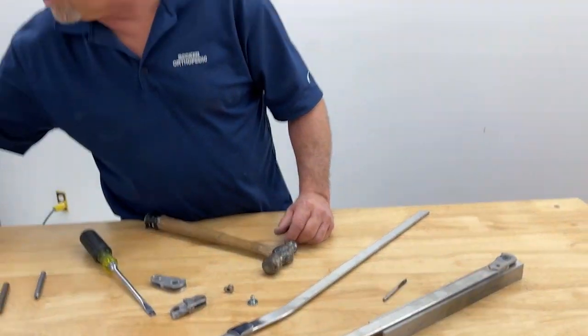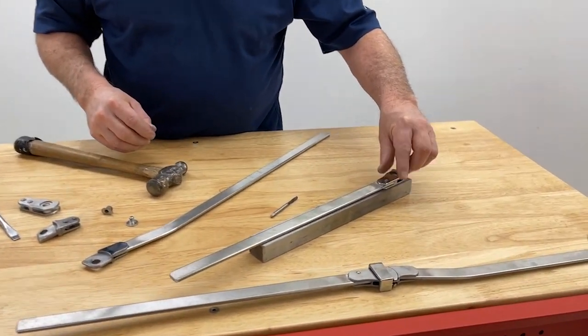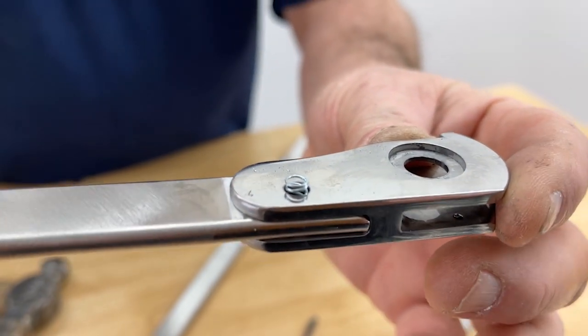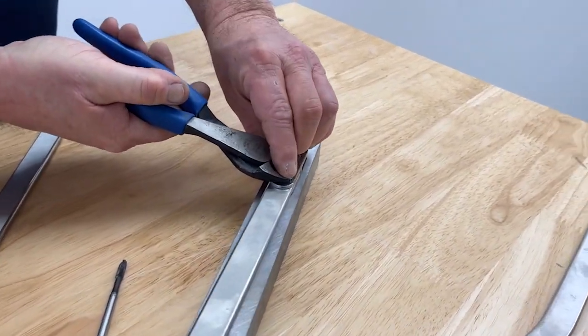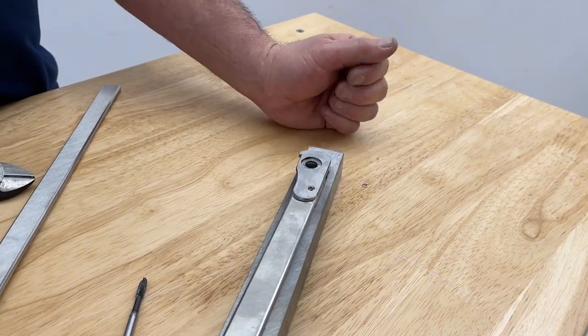I'm going to install a spring. One of the things you'll notice is that the spring stands proud of the joint — we want to cut that off flush with the joint. I'll use a pair of side cutters. That's nice and flush with the joint.